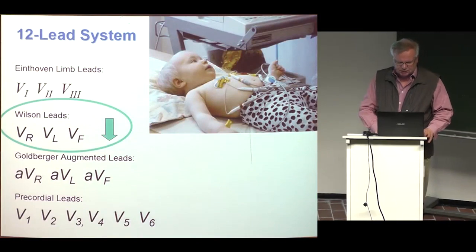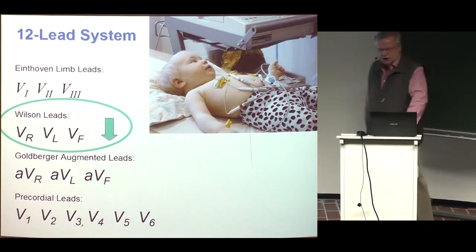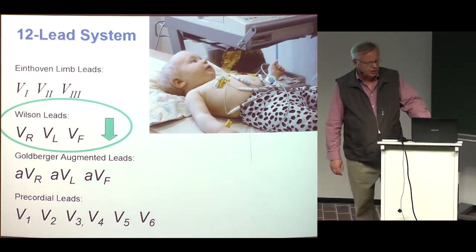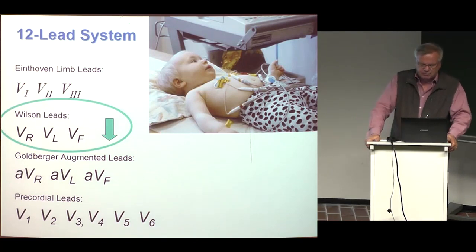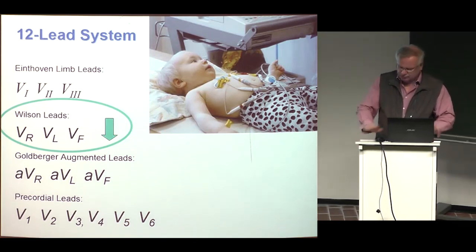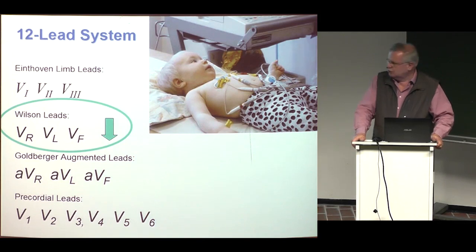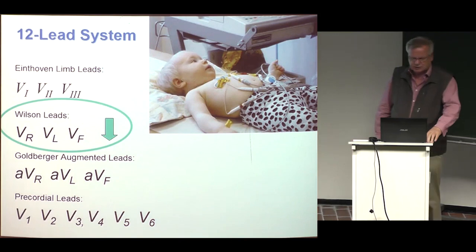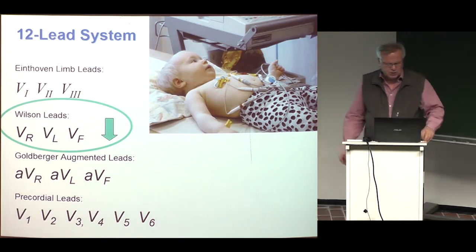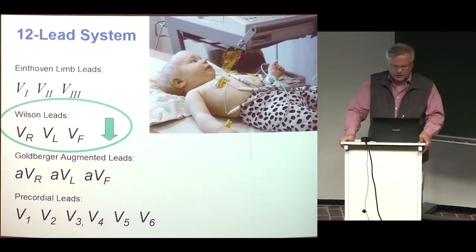The 12-lead system is the standard electrocardiographic recording method which has developed during history. If everything that has been done and used in ECG would be forgotten and abandoned, and a new standard lead system should be developed, I am quite sure it would not be the 12-lead system. But for historical reasons, it is today the standard lead system, which I've already discussed, but I just repeat it here, and I come more to the details.